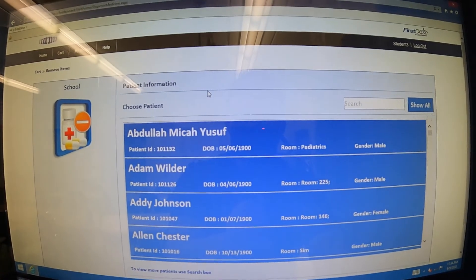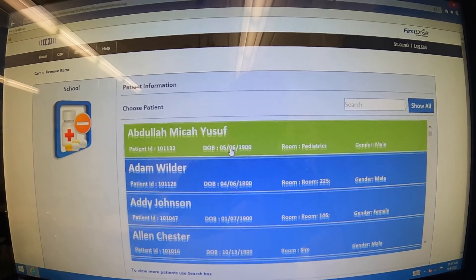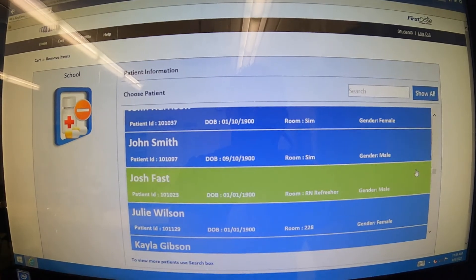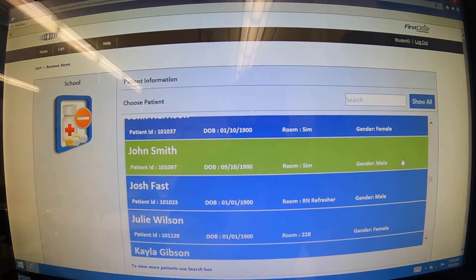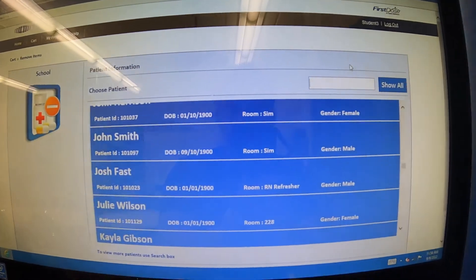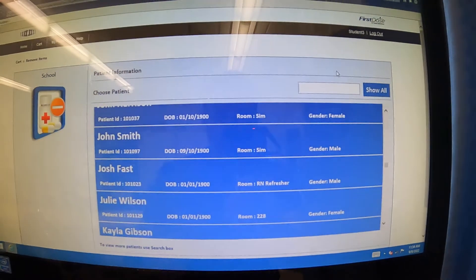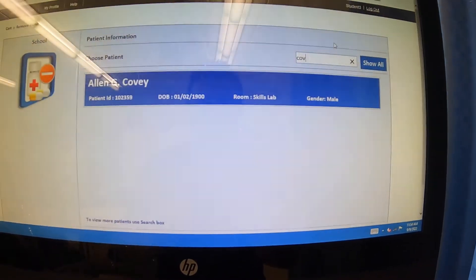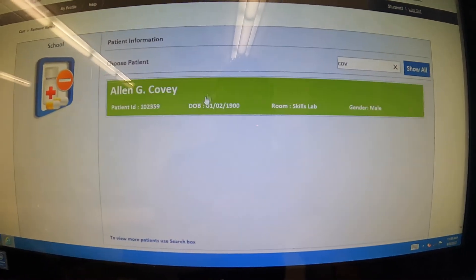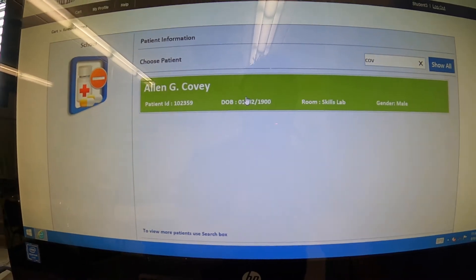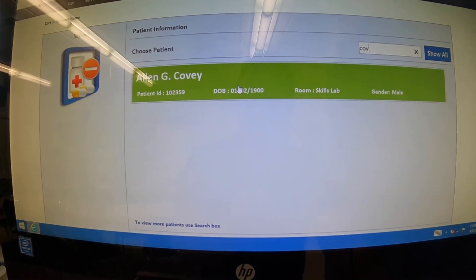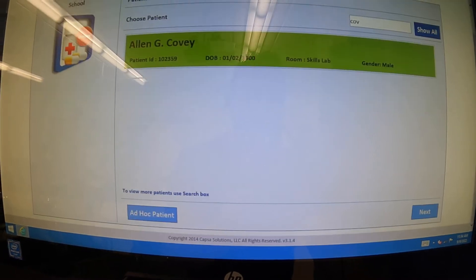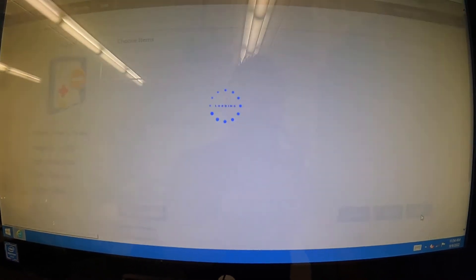Once you're at this point, you have two options. You can scroll down manually using the tab all the way, but that might take you quite a long time. So I recommend that you use the search bar. My patient for demonstration is going to be Alan Covey, so I'm going to type the first couple of letters of that. It looks like Alan Covey popped right up. I'm going to compare it to my paperwork to make sure I'm selecting the correct patient, then I'm going to go ahead and hit next.